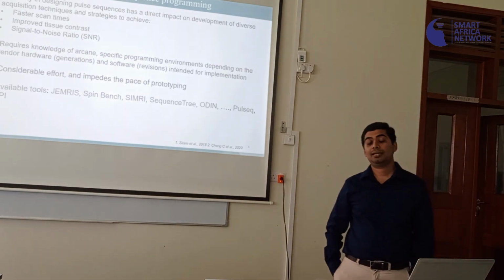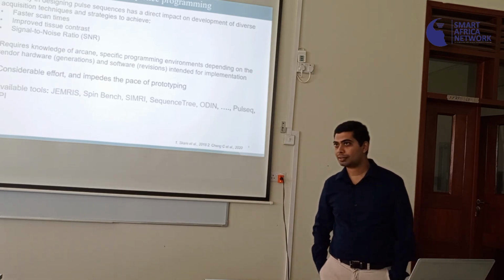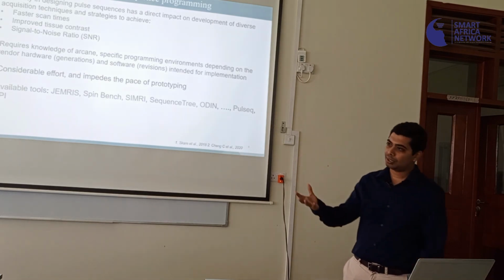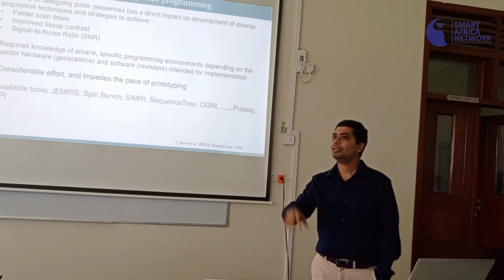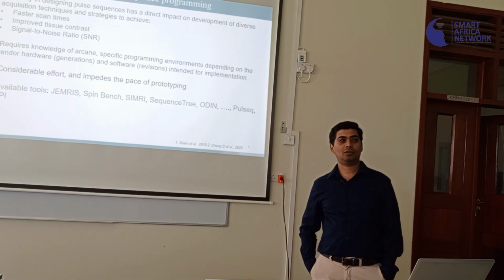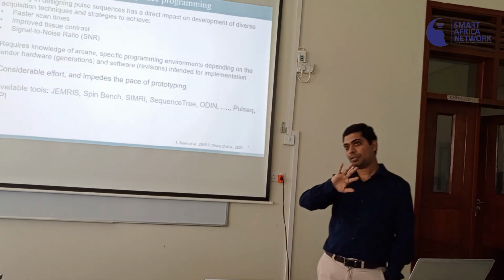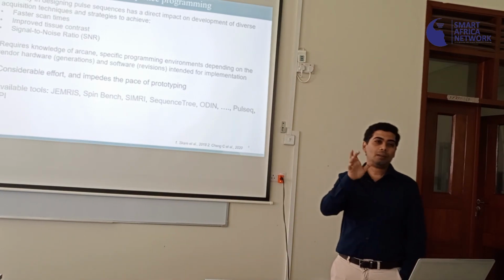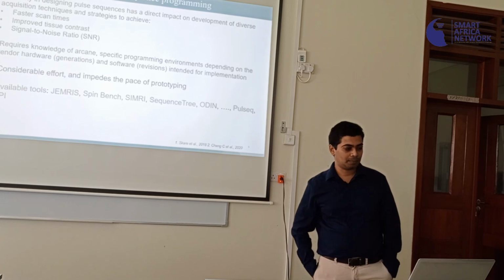By doing this, you can look at different kinds of contrasts, meaning if you're after a particular part of the anatomy, you want that to get highlighted. For example, if you wanted to look at black versus white, white versus black, gray, then you probably tinker and tailor a little bit of how these pulses would be played.